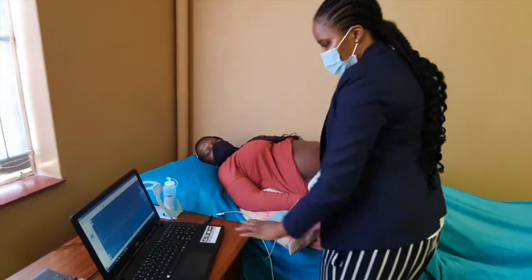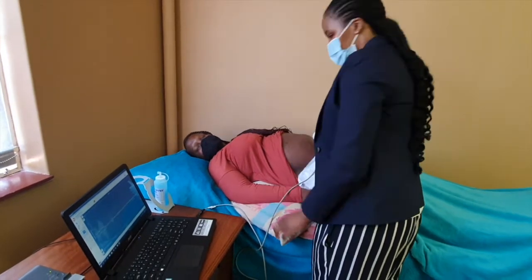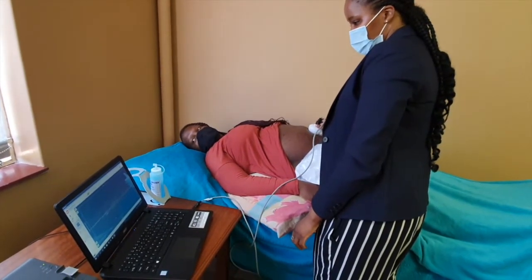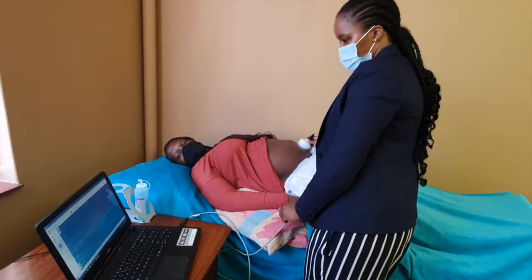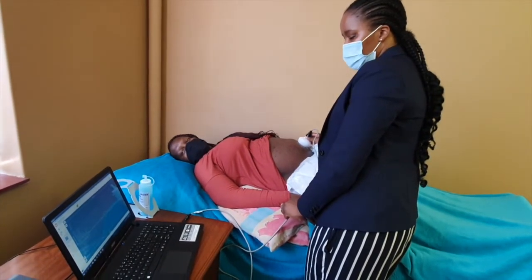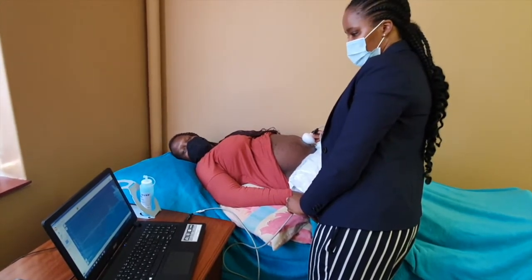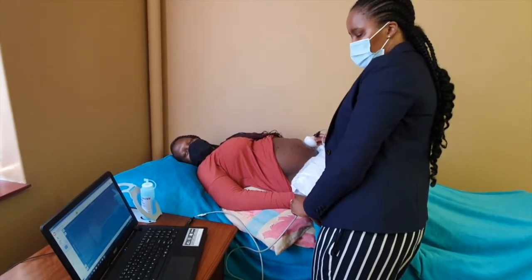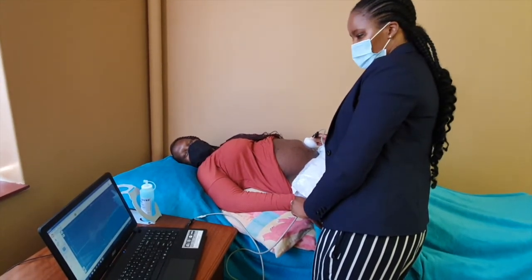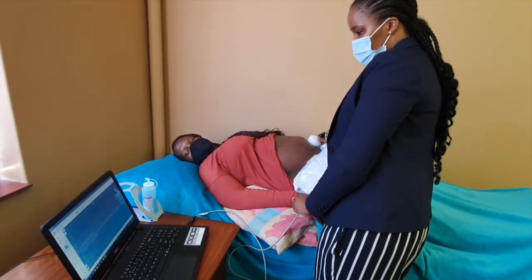Palpation of the abdomen, as shown before, is important to examine the fetal lie and the position of the fetal spine. Ideally, one starts examining the abdomen with the Umbiflow device on the opposite side of the fetal spine, where one would expect the fetal umbilical cord to be. The device is moved on the abdomen until the doctor hears a good audible umbilical artery signal and sees a good quality waveform on the screen.